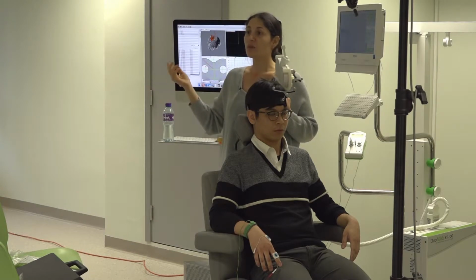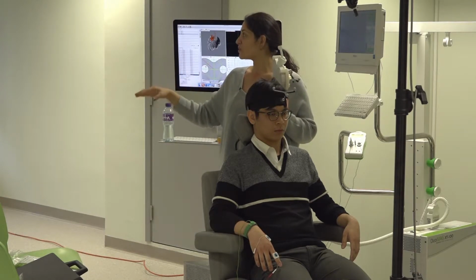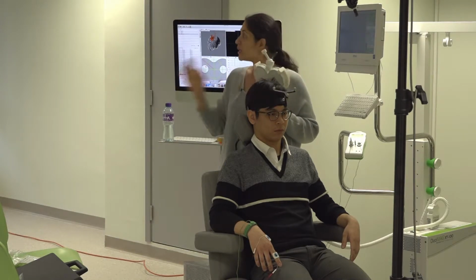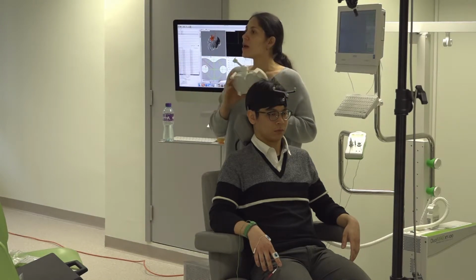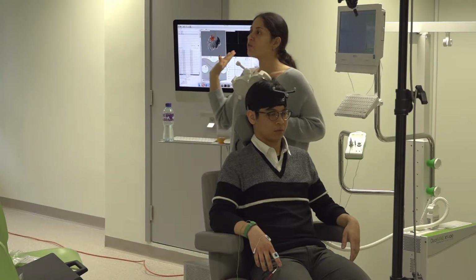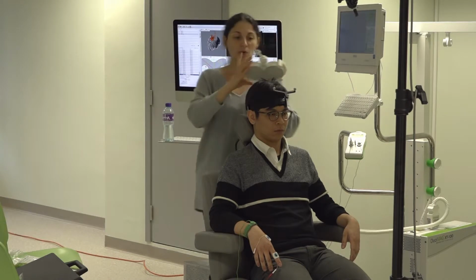And he got it this time, but maybe he will not get it next time. I don't want to send you bad luck, but it's like beginner's luck. It was really, really easy, very good. It was fine. I think it's just a matter of practice. You need to practice, practice, practice. Okay, you found the hotspot. We say this spot from, what's your name?